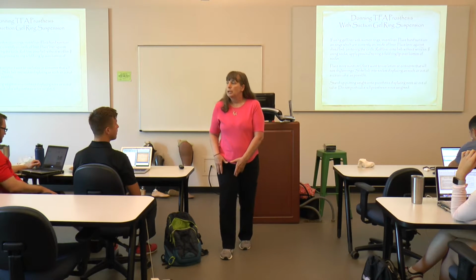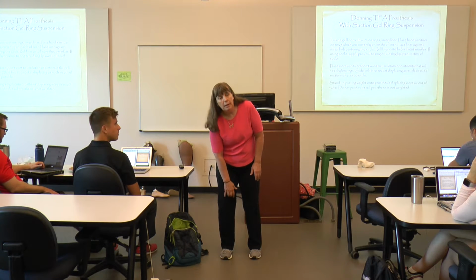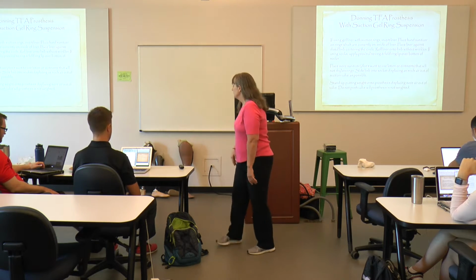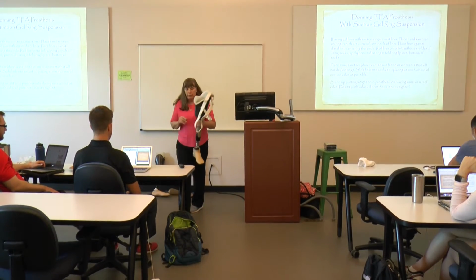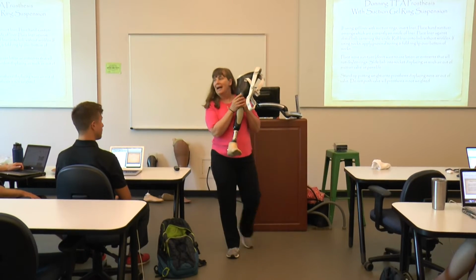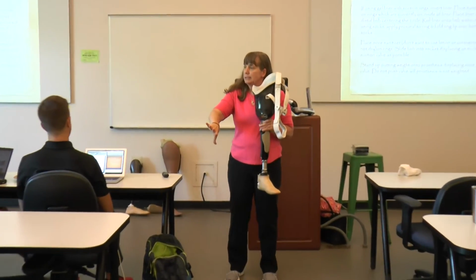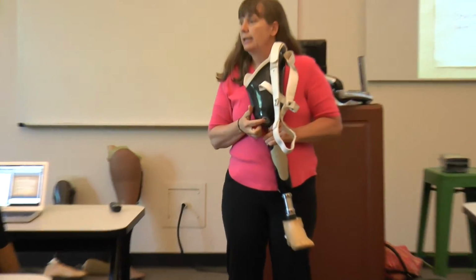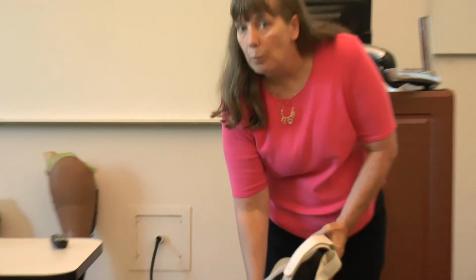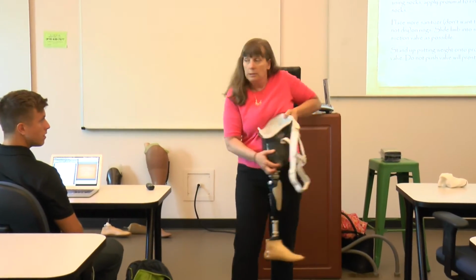Stand up and put pressure on it and let the air push it out. When I first get up, the valve in these is a one-way valve. If you're not pushing it, that only lets air out. Okay? So as I stand up, put weight on it, the air compresses out. But if I want to sink deeper, which I need to get all the way down in it, I push the button in the middle, right here, while I've got weight on it.